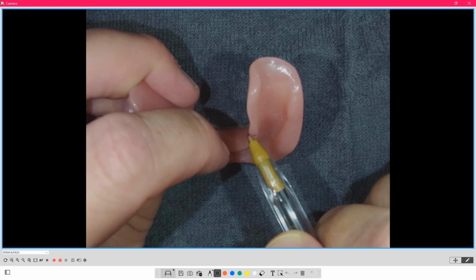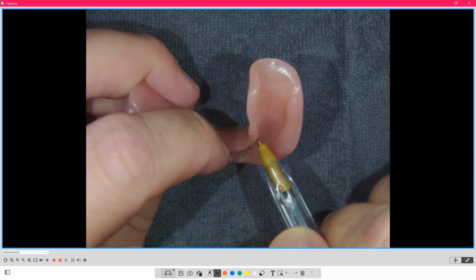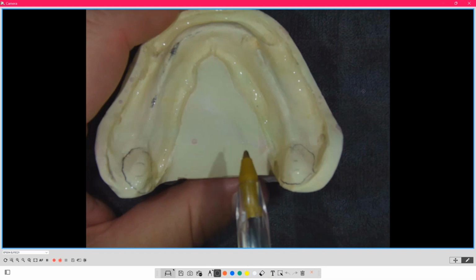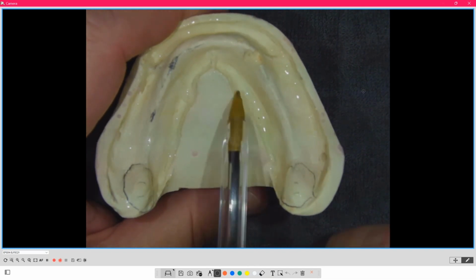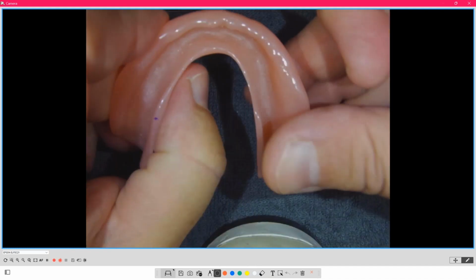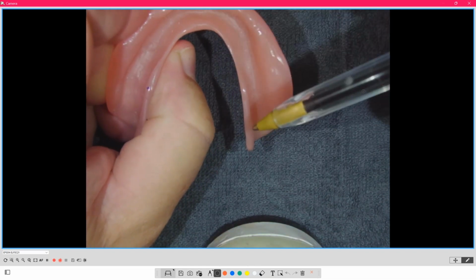So their tongue interprets, due to the thickness, that there's a gap here, and there in fact is not. The reason being is because, remember, on the lingual we have an S curve. So we usually see a nice S curve, but when we finish a denture, rarely are we trying to address that S curve into the finishing.